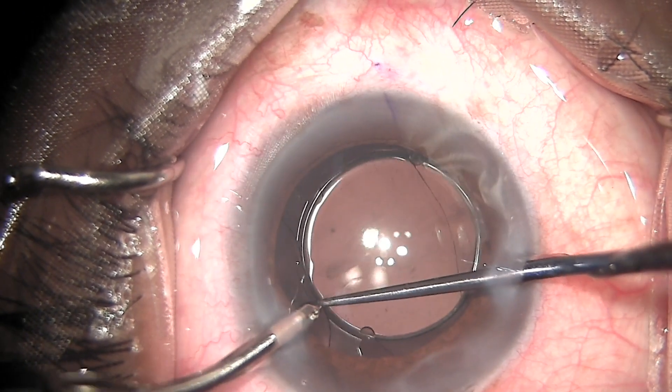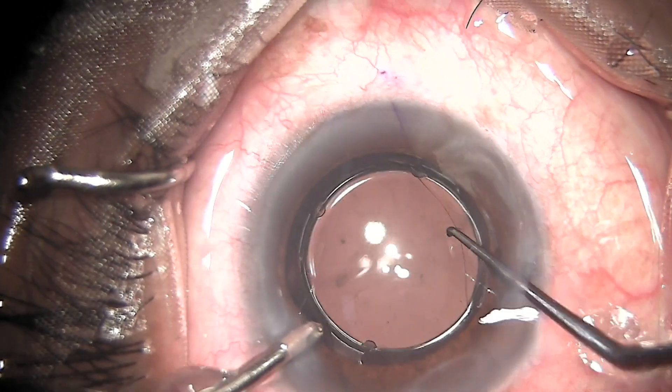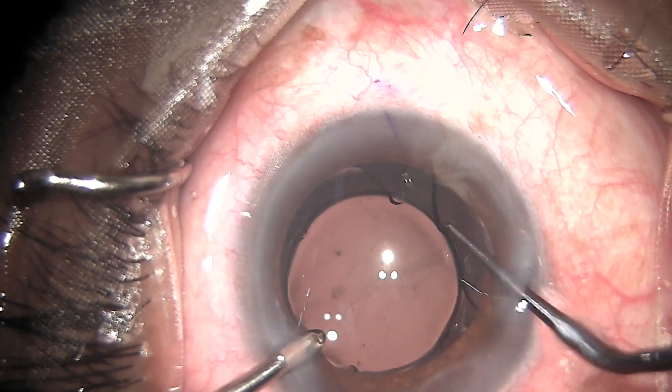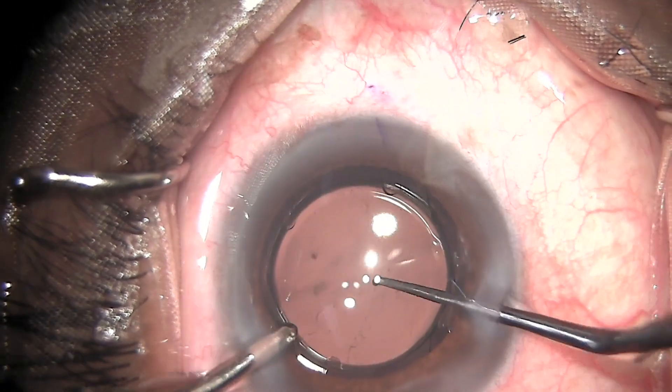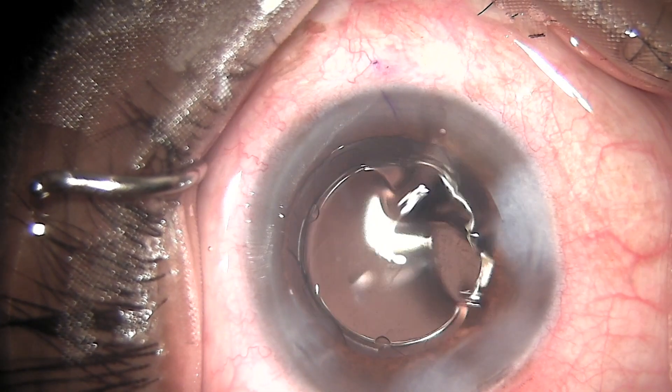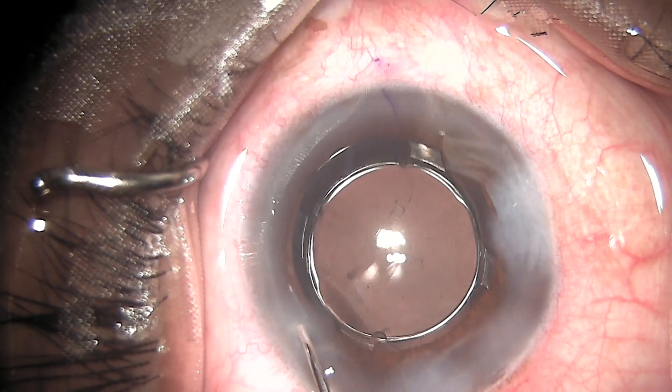Now I am attacking the clip on the left side. The small clip is being pulled up over the anterior capsule, followed by the last clip on the lower side, which again can easily be pulled and placed. You can see the lens is very well placed, well centered, and well fixed.